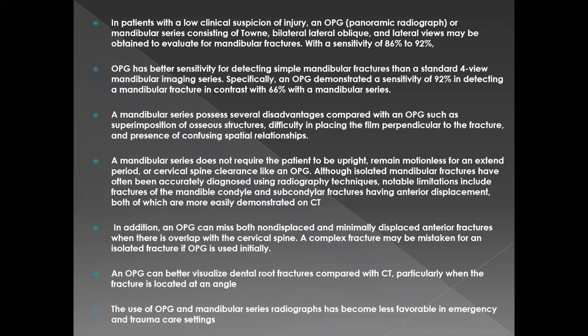Okay, we have a question over here. I've been asked for a plain X-ray of Stenson's duct called puff cheek view. I didn't find it anywhere.